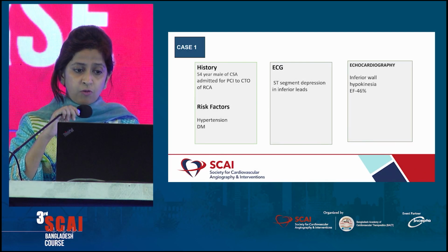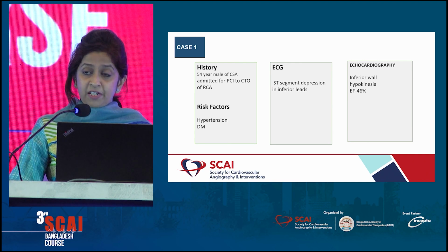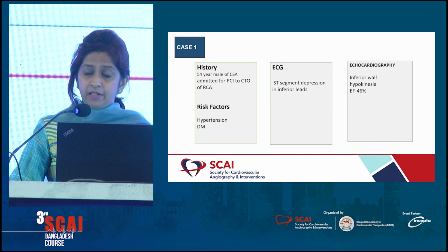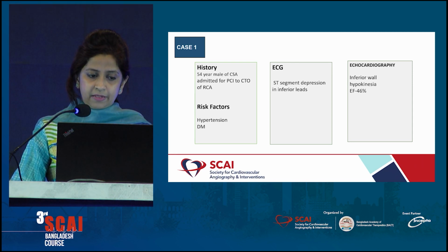My case is a 54-year-old patient of chronic coronary syndrome with hypertension and diabetes, admitted in our hospital for PCI to CTO of RCA. In ECG, there was ST segment depression in the inferior leads, and in echocardiography, there was inferior hypokinesia with an ejection fraction of 46%.